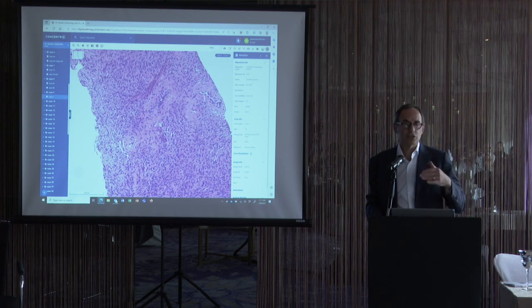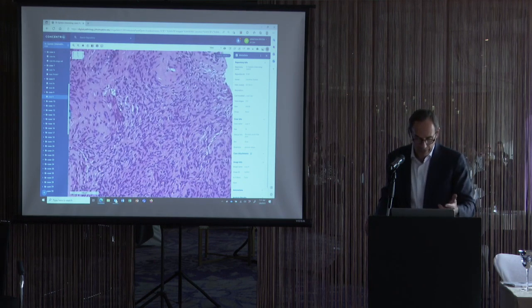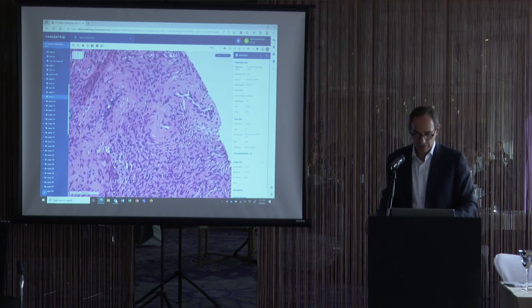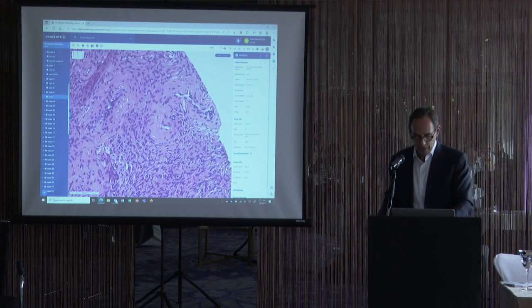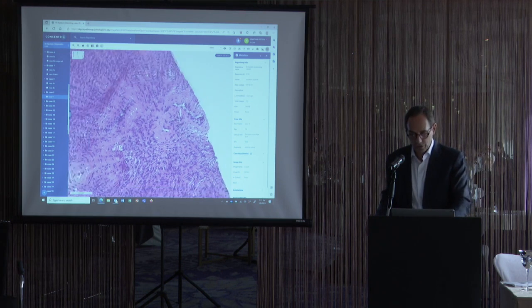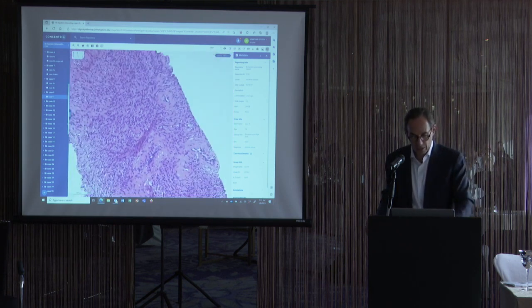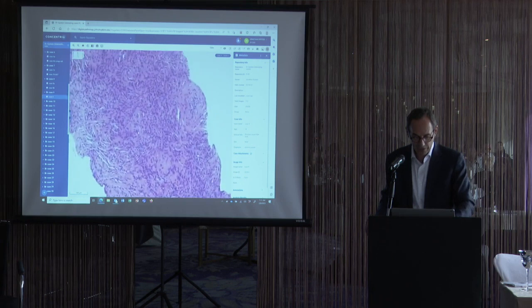So how do we tell it's a stromal nodule of BPH as opposed to a stromal neoplasm? The key is actually not the stroma; in the stroma, you can't tell. The key thing is the vessels. When you see small capillaries with a thick vessel wall around them, that's classic for a stromal nodular BPH. Normally, in any other tumor or normal structure, these thin little capillaries wouldn't have this thick wall. The thick wall is disproportionate to the size of the capillary. The stroma itself can be extremely cellular, but there's no atypia and no mitotic figures.